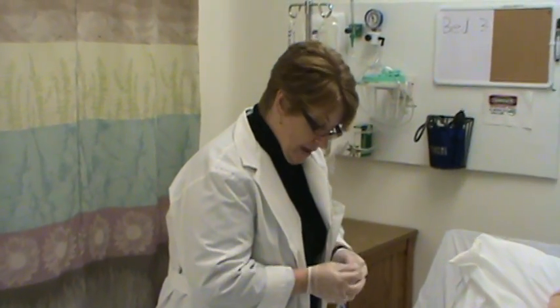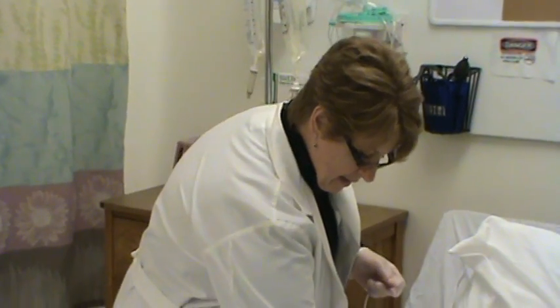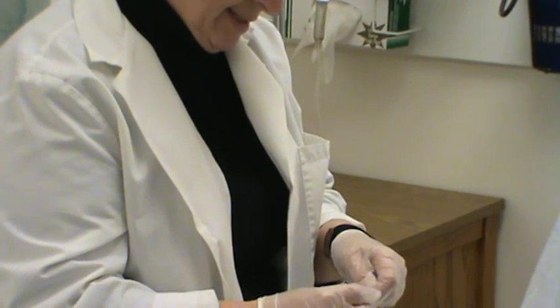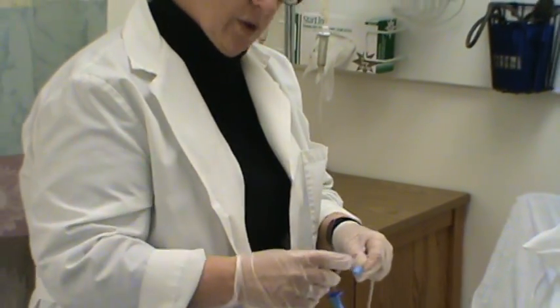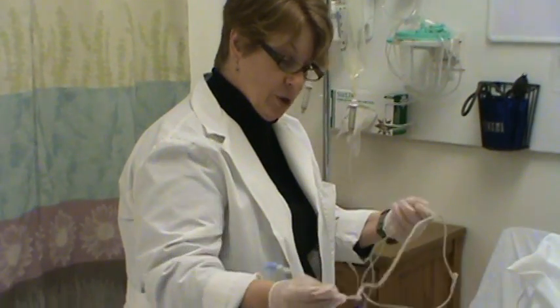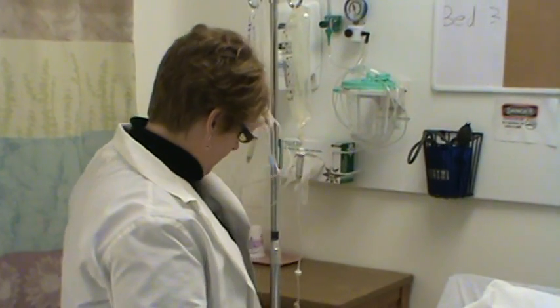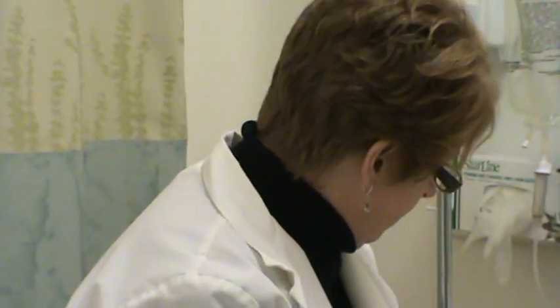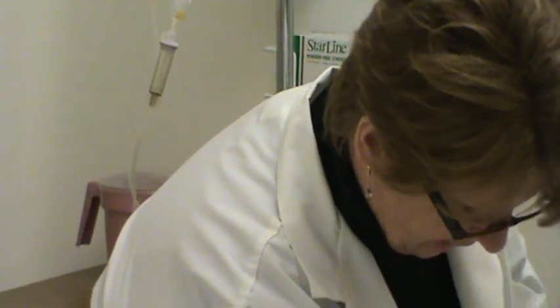Now what I would expect you to do is, just for the purposes of our return demo, put the blue cap back on the system, not in use, so that the next student who comes in has a supposedly sterile new system to swap out with that. And then you leave this hanging up here for them, and you've got your other system, no kinks, no problems there. The tape is in place. And that's how that will go.